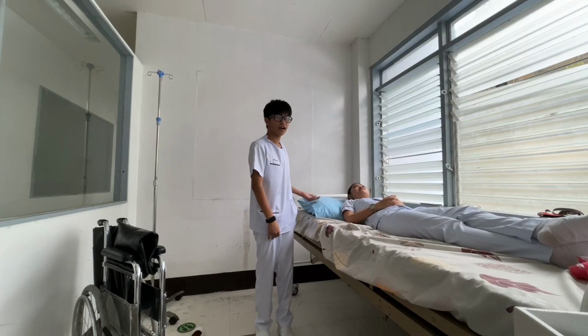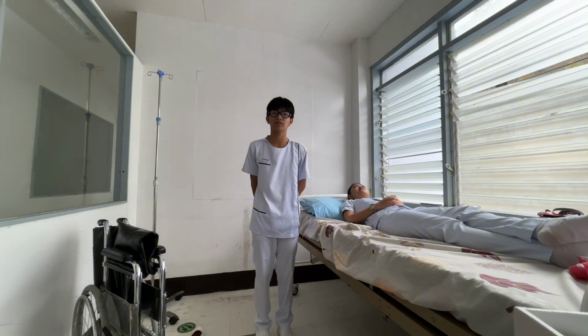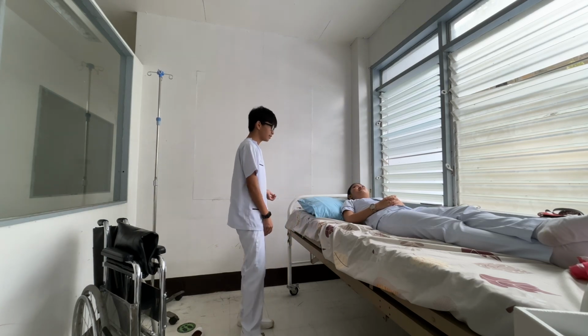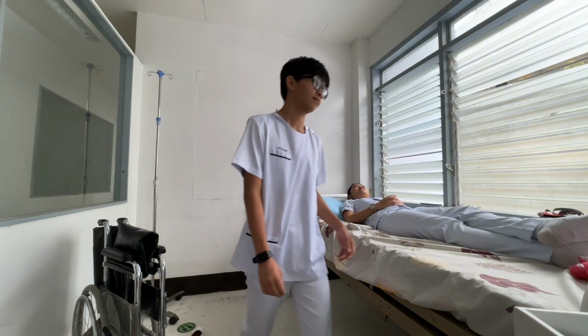Then place the bed to the lowest position and raise the headrails of the bed as high as the patient can tolerate. So assuming that I've already lowered the bed, I will now raise the head of the bed as much as the patient can tolerate.